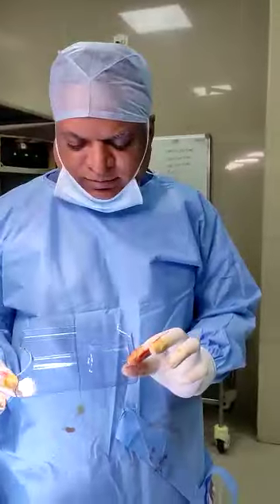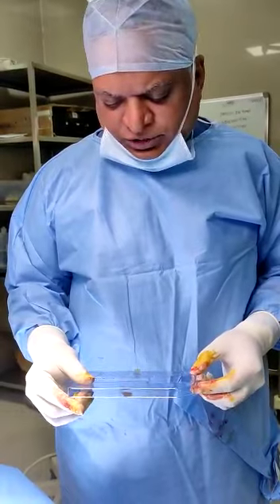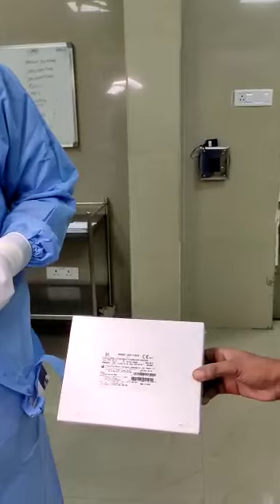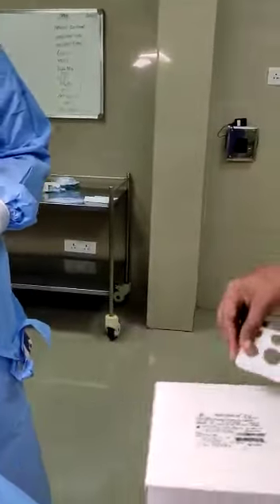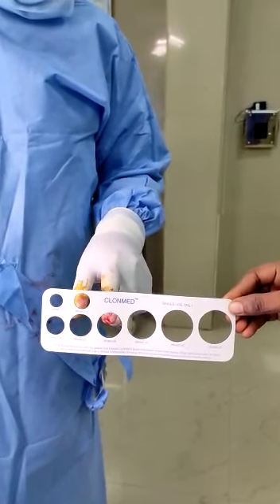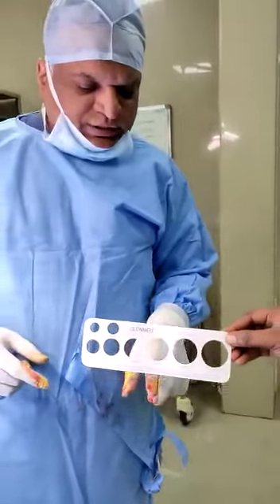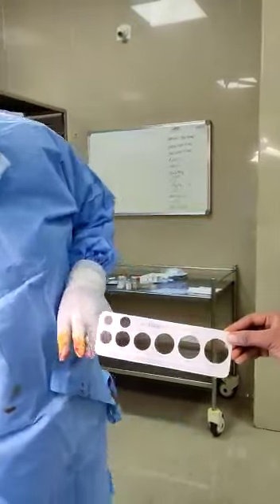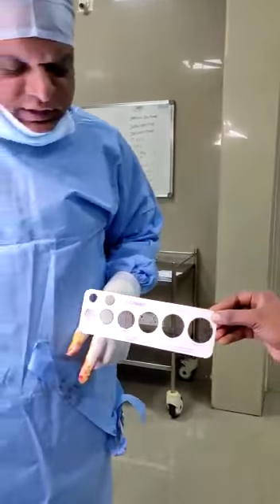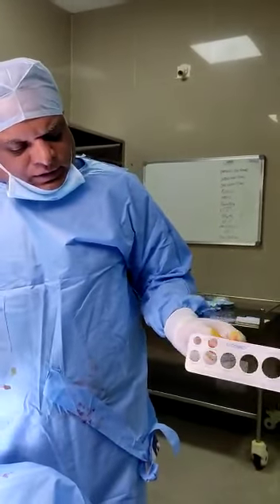I am Dr. Kumar and I am going to describe the components of the stapler we use for circumcision. This comes in a small box, and depending upon the size of the girth of the penis, we have to mark exactly what the size of the penile shaft is. It comes in small sizes for kids, up to 30, 32, 34 — normally what we use is about 30 and 32. We decide which size is required by using this scale.